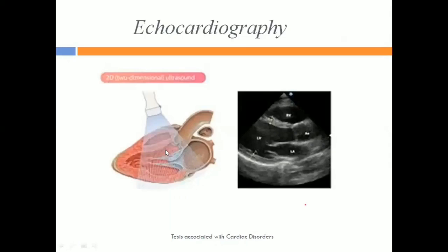Next, echocardiography, the echocardiogram report, where we are sending sound waves to the heart, and based upon the different chambers, the resistance, and the different parts of the heart, the sound waves will reflect back. If you see here, we have the valves, and the open auricles or ventricles, where the sound waves won't reflect immediately. Whereas at the upper part of the heart, the outer surface, there might be a chance of reflecting the sound waves immediately when compared to the valves and those kinds of things.